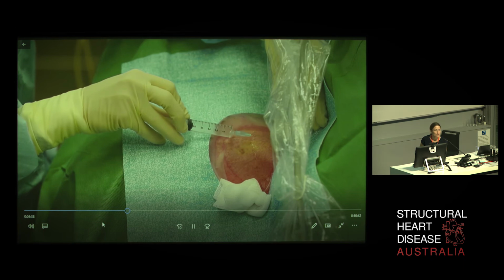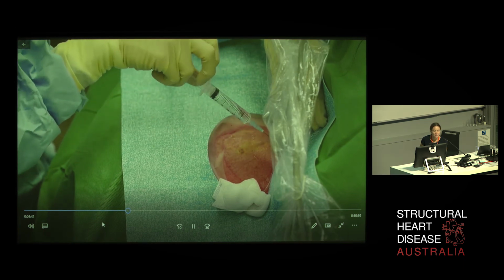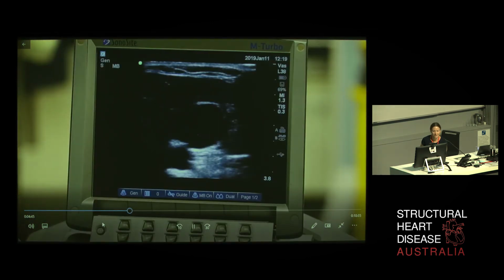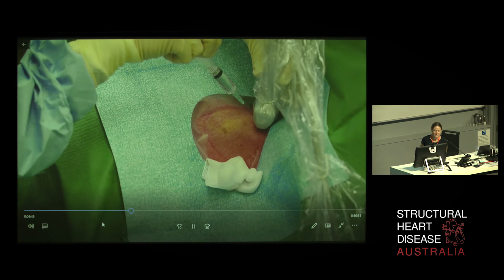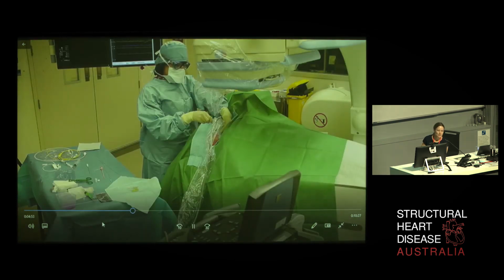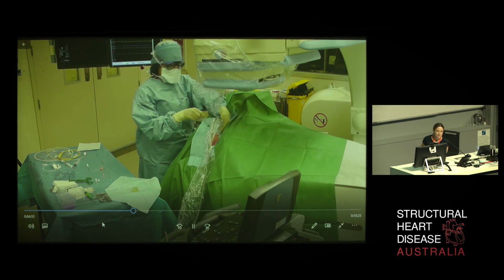It's interesting when you use ultrasound, the variance in anatomy. In the past, we didn't use ultrasound. We sort of dug around. Whenever you're advancing, always pull back. So I'm advancing slowly, but with pressure pulling back. You don't inject into the vessels.